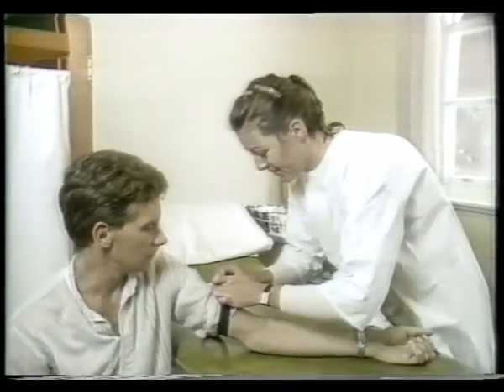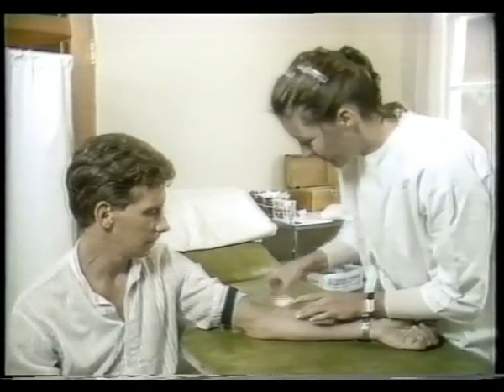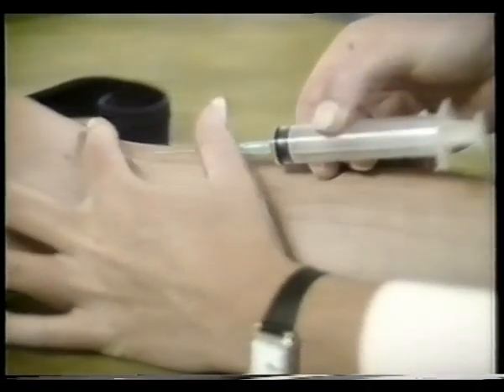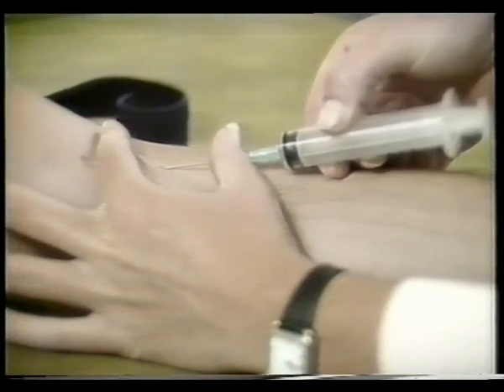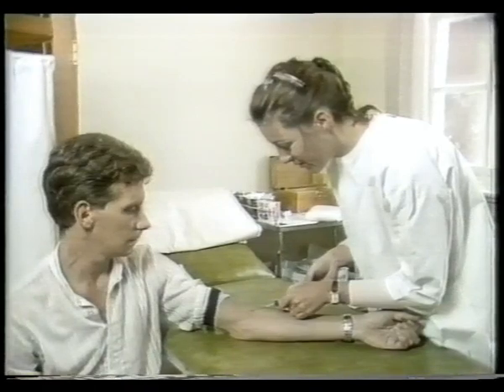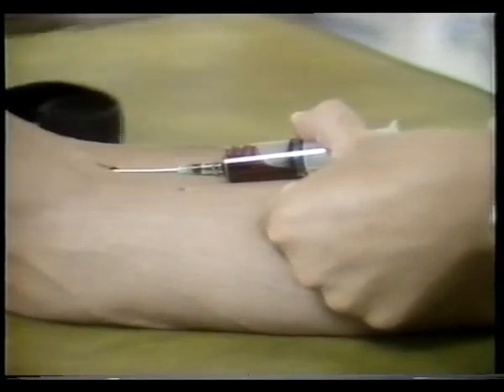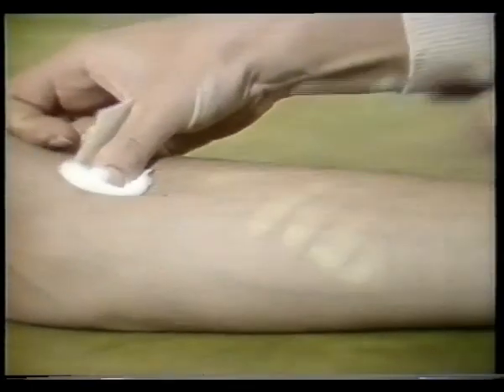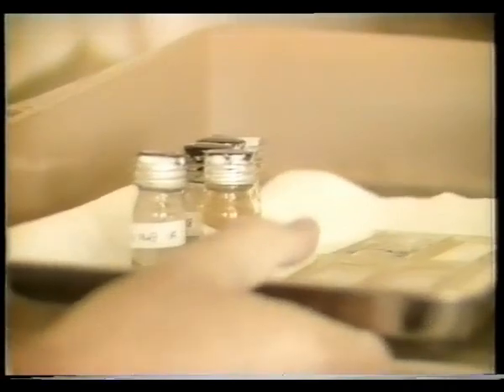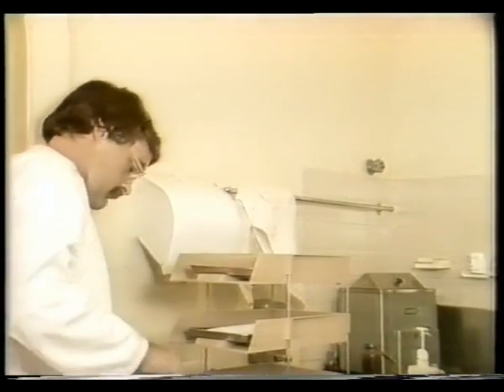Syphilis: it is currently not possible to grow Treponema pallidum in vitro in the laboratory, so we are dependent upon serological tests for the diagnosis of syphilis. Blood tests are taken and sent to the laboratory for serology. Overall, all STD specimens should be processed as soon as possible, because the majority of etiological organisms are killed by temperature change and drying.